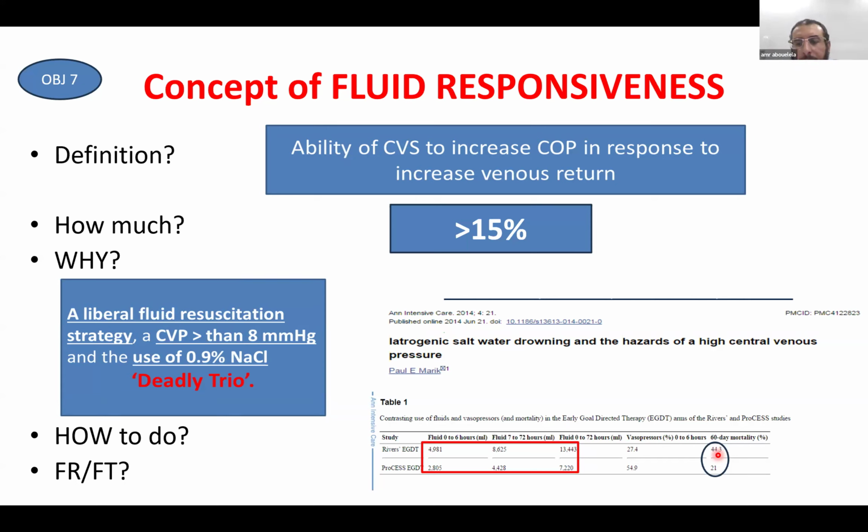And I will come, in the next slide, to two other important graphs and studies explaining the importance of fluid responsiveness. How to do it, this is the last station, how to check fluid responsiveness, we will talk about later on. But I just want to emphasize the last point, which is fluid responsiveness versus fluid tolerance.